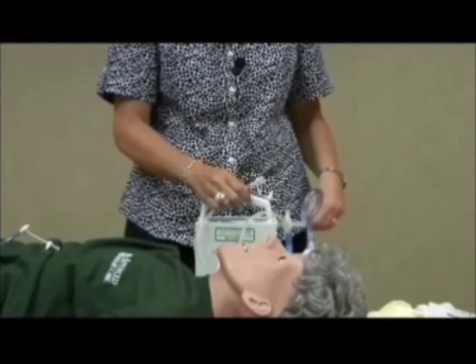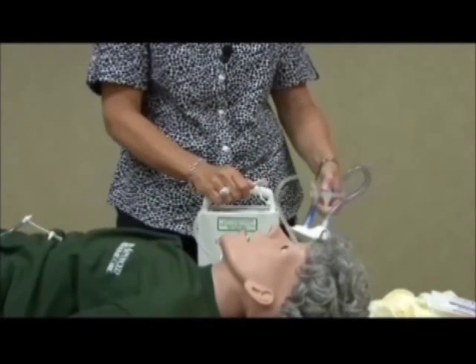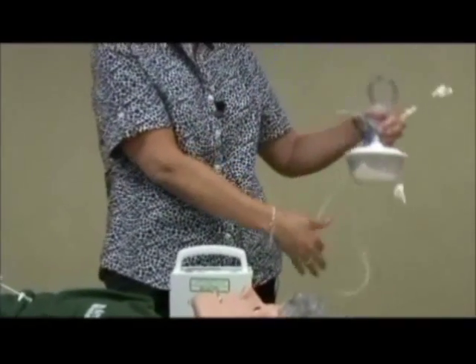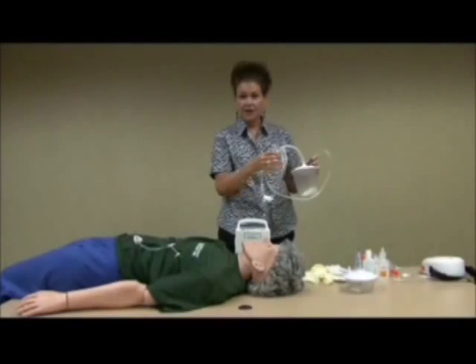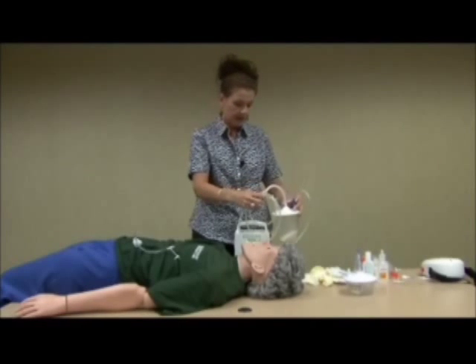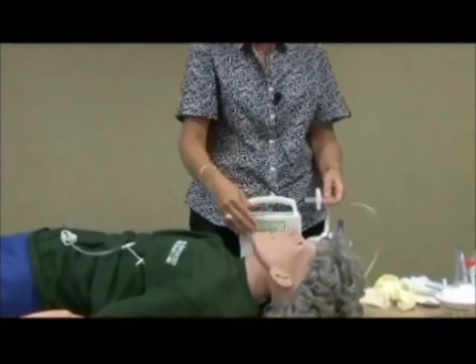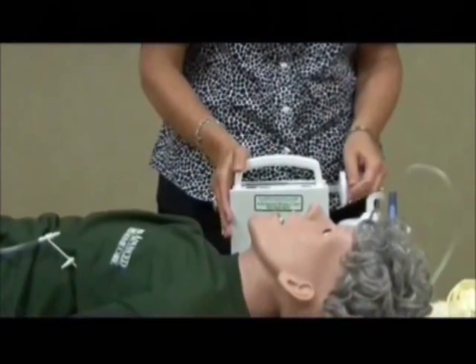Now you'll need to remove your canister by unscrewing the bacteriostatic filter from the side of the machine, taking the canister and tubing and disposing of it in your regular trash. Now you're ready to replace your canister. You'll obtain one from your medical supplies, place it in the canister holder, and attach the bacteriostatic filter to the side of the machine, making sure there are no visible kinks in the tubing.